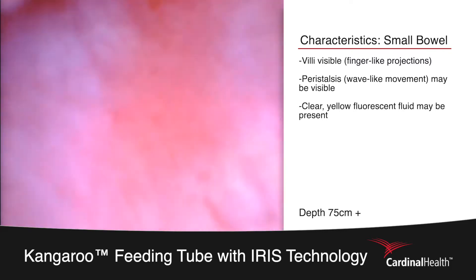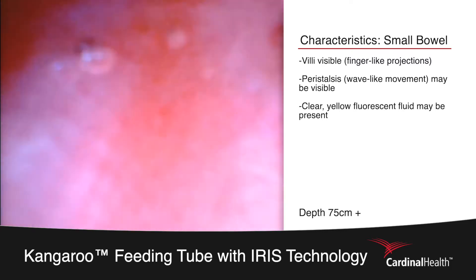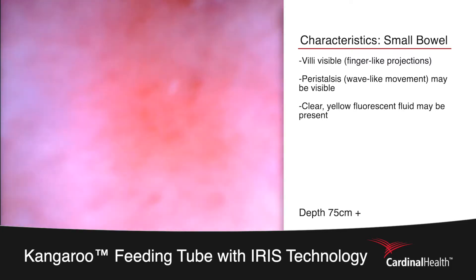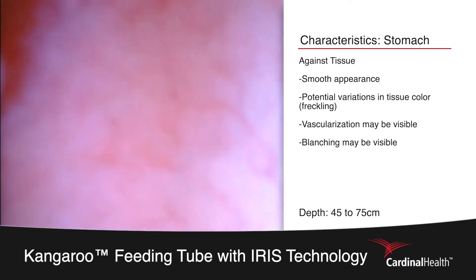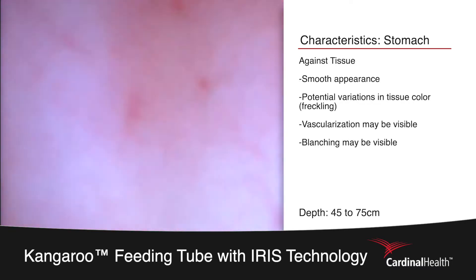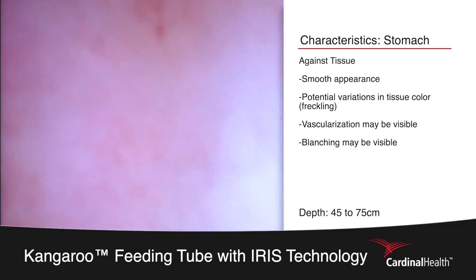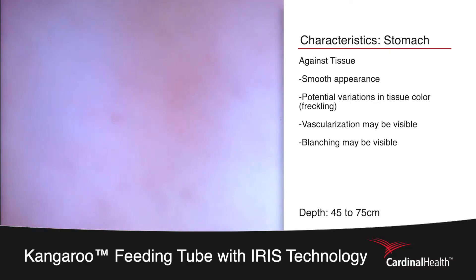In this procedure, the placer retracts the tube from the small bowel into the stomach, as can be seen by the tissue change. As the placer progresses the tube back towards the small bowel, you will again visualize the pylorus.